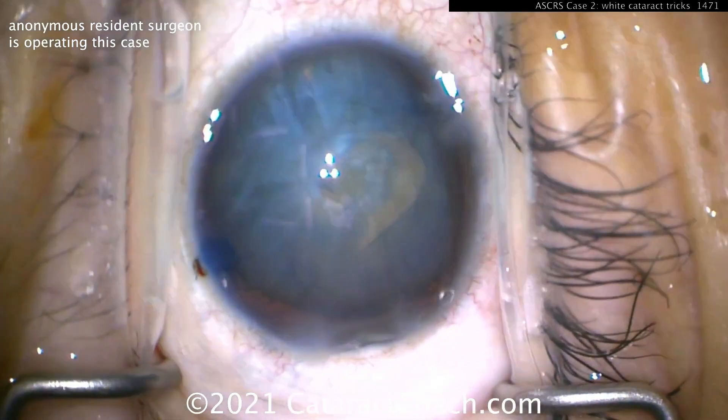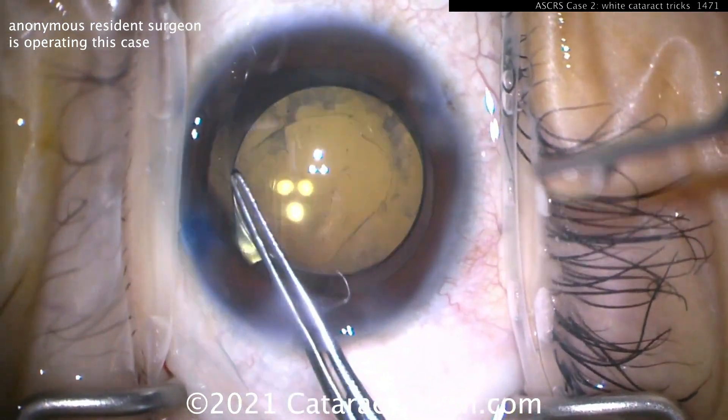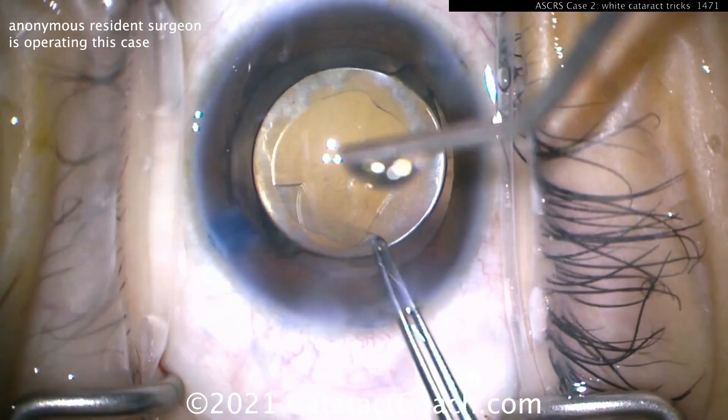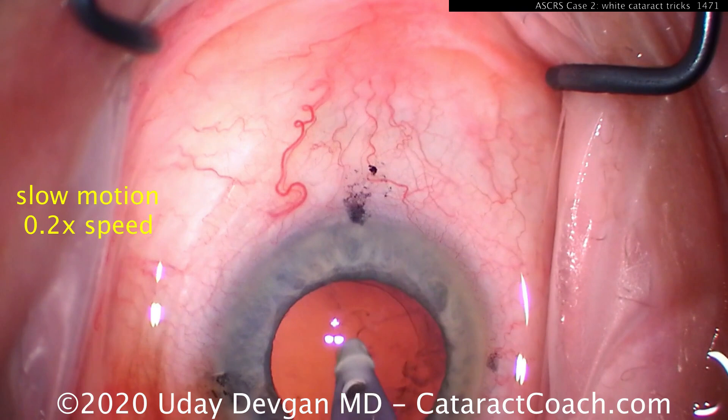And now you can, with the other hand and a cystitome, create any kind of small, irregular opening — as long as it's round for the rhexis, as long as there are no loose edges that will run out. And at the end of the case, after the IOL was already in the bag, that can be enlarged.